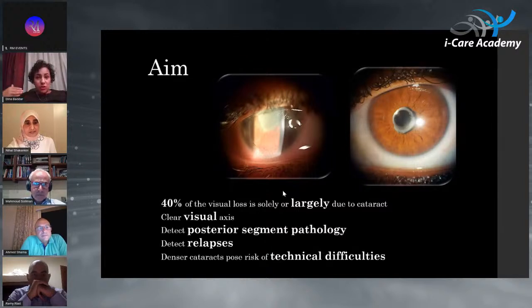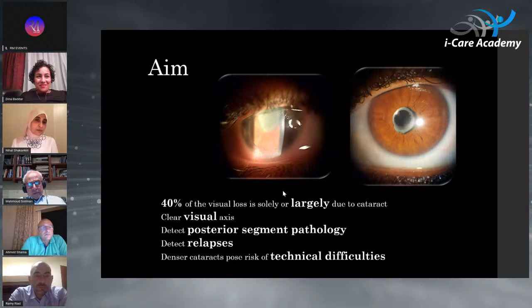Dr. Nihal, because your patients are in the pediatric age group, do you find any differences in the posterior capsule? Well, actually, in everything: in the dilatation of the pupil, and I'm going to show this in the presentation, all these difficulties in the dilatation of the pupil, in epilenticular membranes, in the fibrosis and calcification of the anterior and posterior capsule. So definitely there is a major difference between the uveitic and the congenital cases.